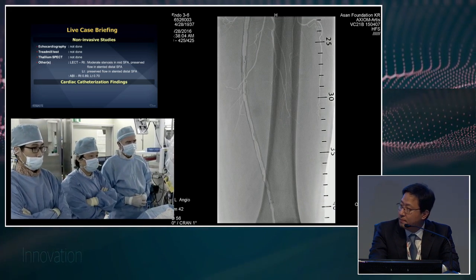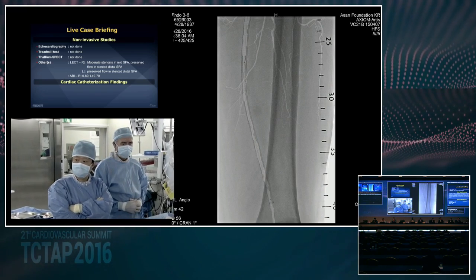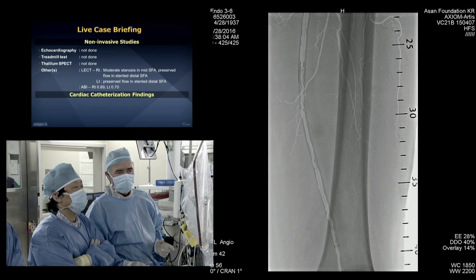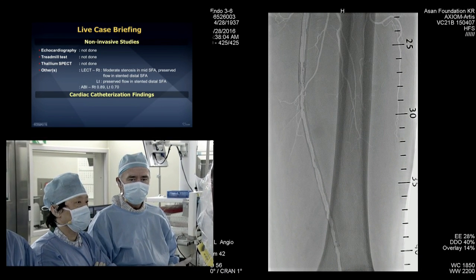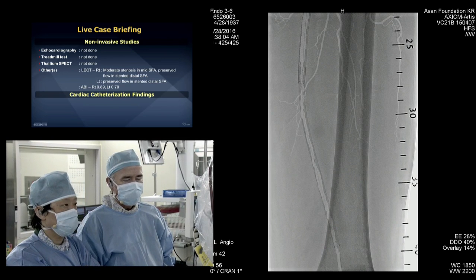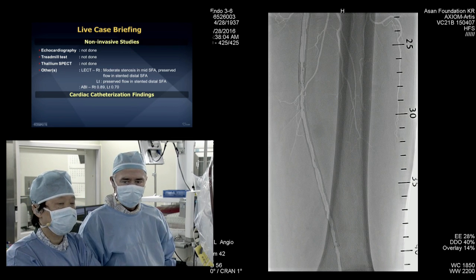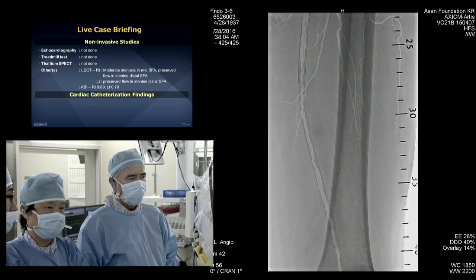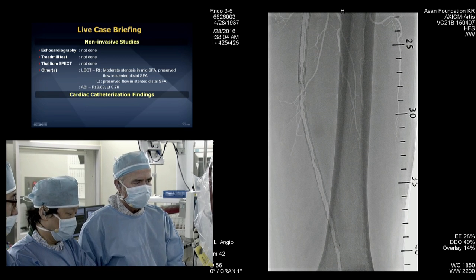A lot of votes for drug-coated balloons rather than stents. Normally at home I would probably debulk with laser and then pre-dilate and use DCB. We're going to skip the laser at this point and just go ahead and pre-dilate. We have a 5-millimeter diameter by 150-millimeter long Savvy balloon from Cordis to pre-dilate with. Looking at the roadmap overlay, the balloon is just a little bit short.